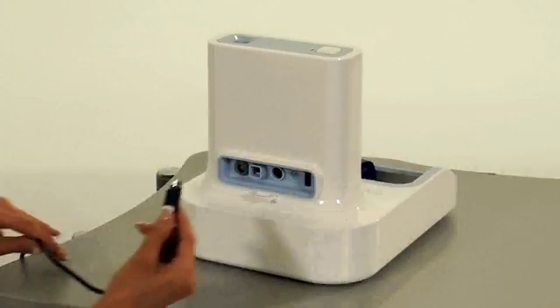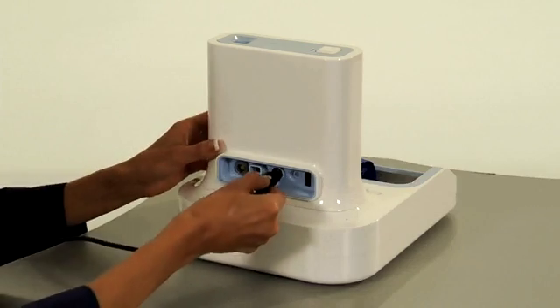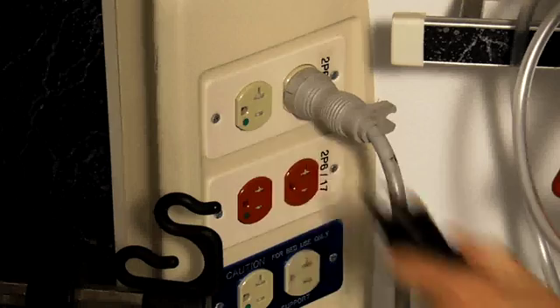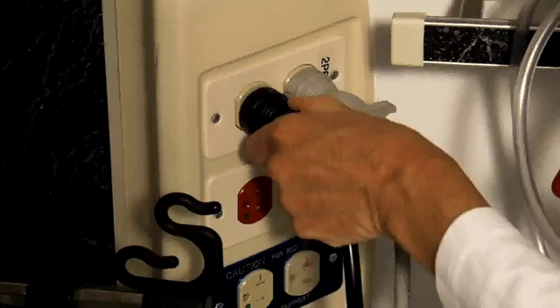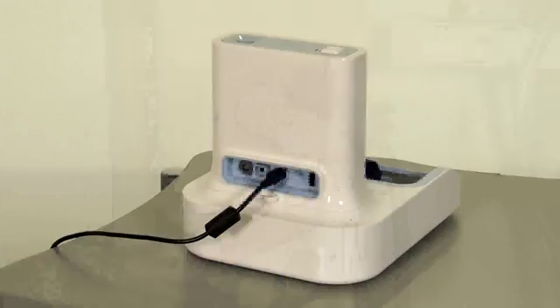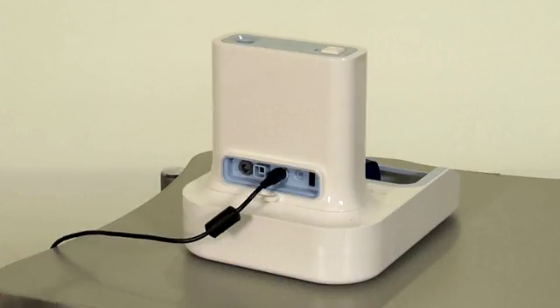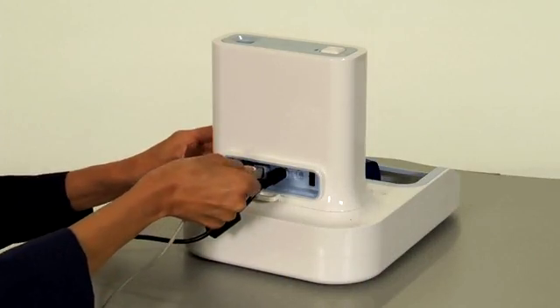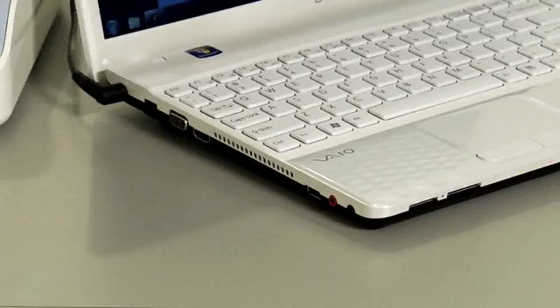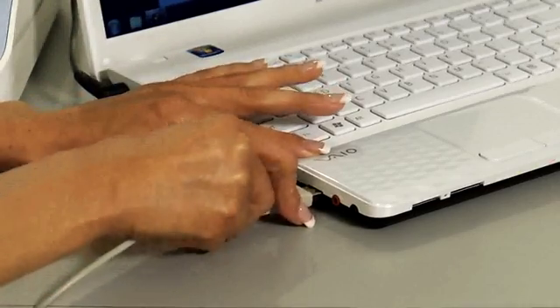To set up the SphygmaCor Excel system, connect the computer and the Excel unit to a power source. Connect the device via the USB cable to a computer where the SphygmaCor software is installed.